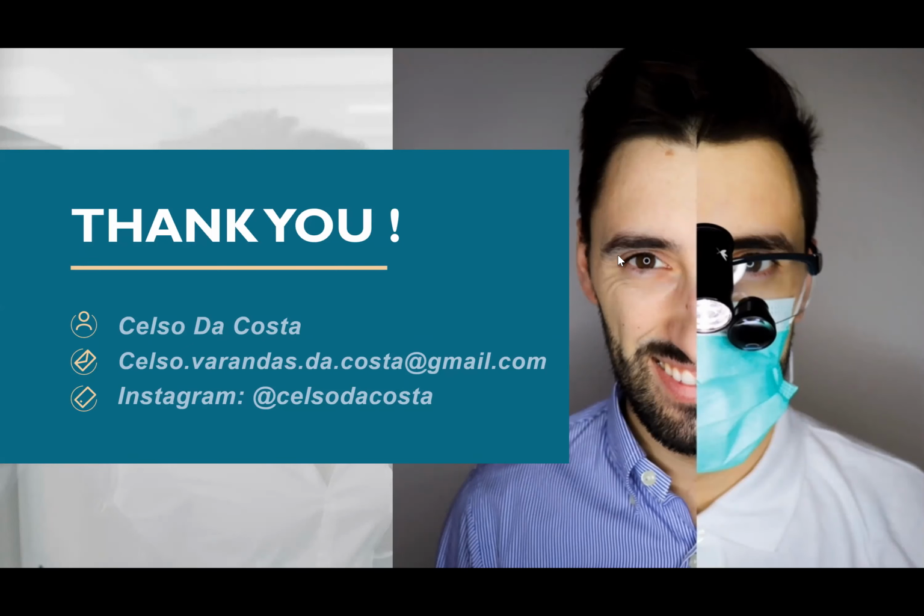Okay, thank you. Carla Pinto asked, do you use Click every 6 months for all your patients? The patients who have already done it ask me to do it. So for someone who is already a B1, I'm going to say no, we can do it next time, and they follow my advice. But the people who come every 6 months and want to do it, and I can see that we can get better results, yeah, we can do it.